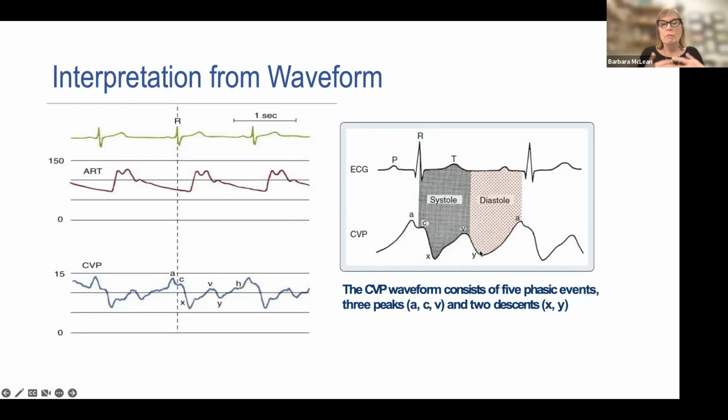Now, in nursing school, if you've ever gone to a hemodynamics class, somebody's talked about this. I'm sure someone's talked about it, but they don't really put it into the reference of importance. And here's the reference of importance. When the A wave is significantly bigger than the V, and that would generally be 2 millimeters or more, A wave, 2 millimeters or more bigger than the V, you have a loss of compliance, period.